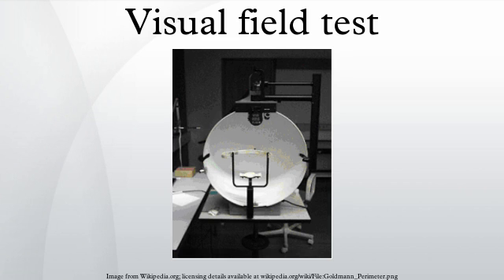Repeating this enough will establish a boundary of vision for that target. The procedure is repeated using different test lights that are larger or brighter than the original test light. In this way, kinetic perimetry is useful for mapping visual field sensitivity boundaries. It may be a good alternative for patients that have difficulty with automated perimetry, either due to difficulty maintaining constant gaze, or due to cognitive impairment.